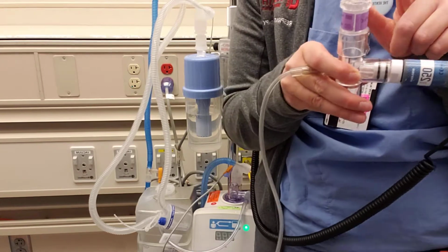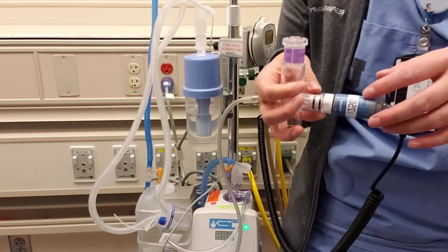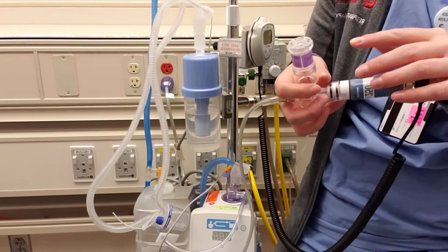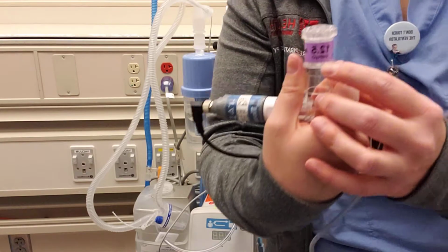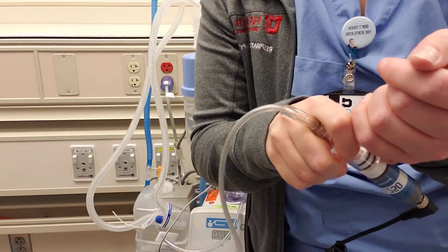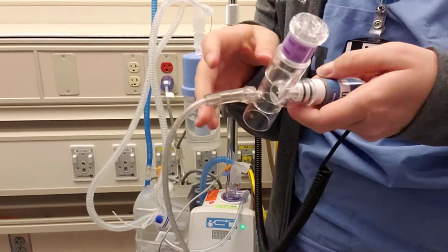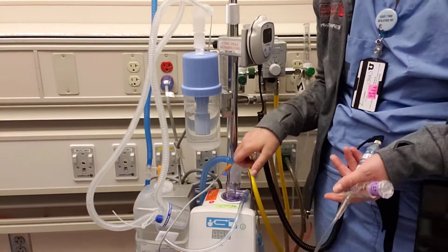We also have a pop-off here so that if for some reason we are having back pressure, we don't go above 12.5 centimeters of water pressure. So this is our safety pop-off valve. It will kind of hiss and you'll hear it vibrate if for some reason you are getting back pressure.